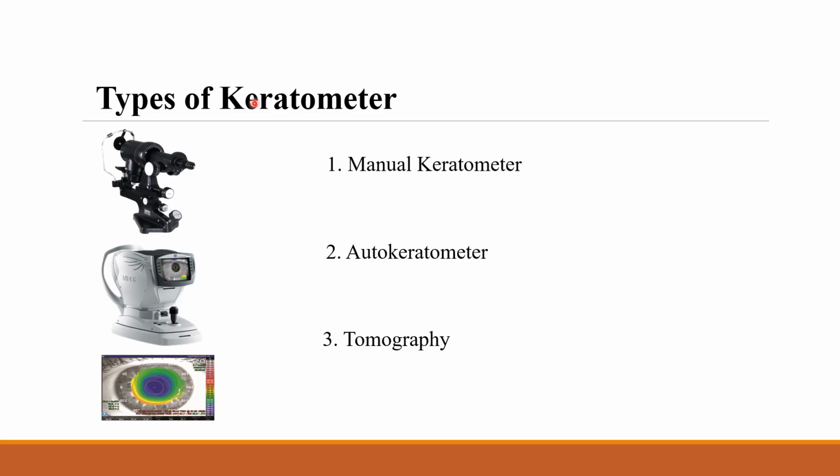Types of keratometer. There are three types of keratometer: manual keratometer, autokeratometer, and tomography.